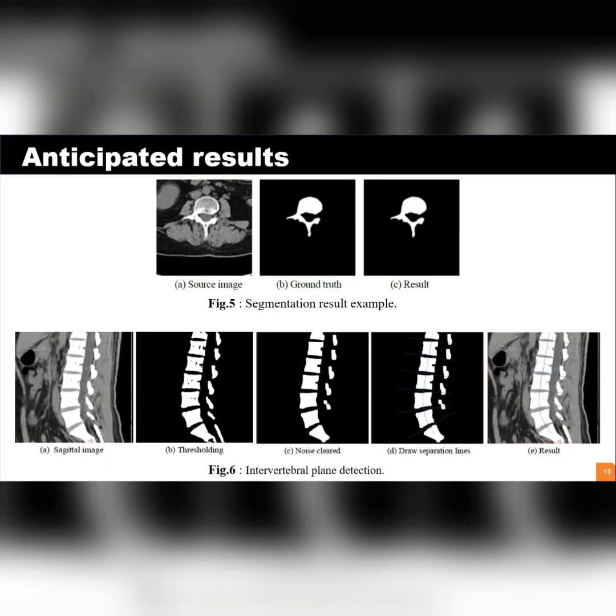The mass center of each region of comparable size to a vertebra is determined and a line is drawn by connecting neighboring mass centers. As shown in figure 6d, normals are generated to choose the central points of each mass center line. These normal lines, shown in figure 6e, are the separating lines used for the intervertebral plane.